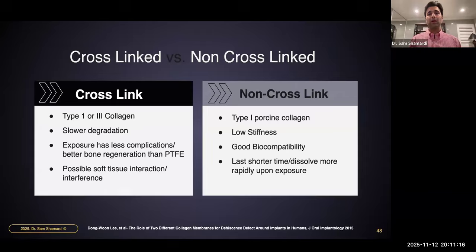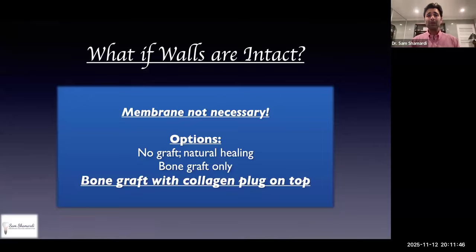The point being that when it comes to talking about regeneration, the different bone graft options and the different membrane options you have, this is a far more involved type of conversation, but these are all part of your overall portfolio and thought process when you enter your case. And again, going back to tip number one in terms of planning ahead, the more information you have, the more you can start thinking about which of these materials you're going to be using, and the better your outcomes are going to be. Now, we talked about these extraction cases.